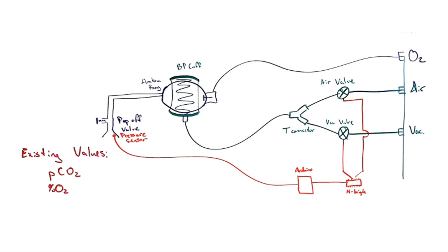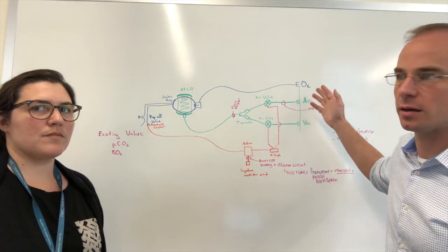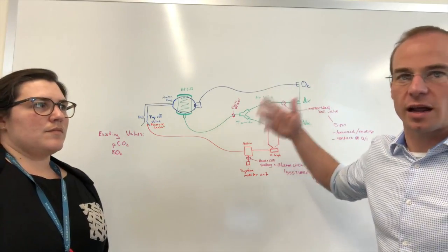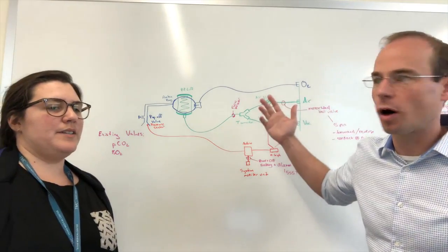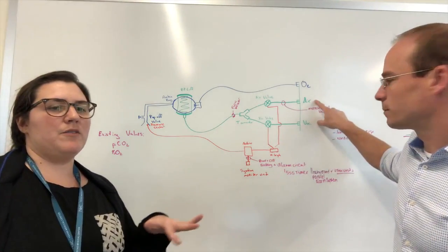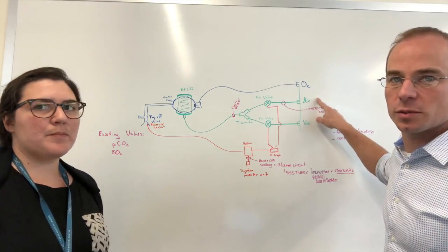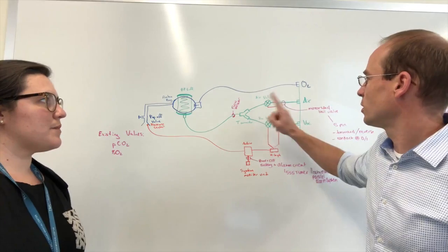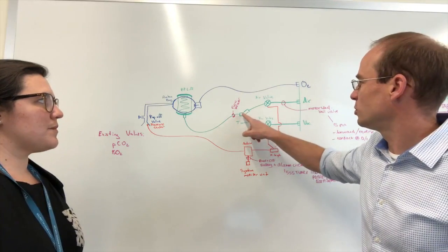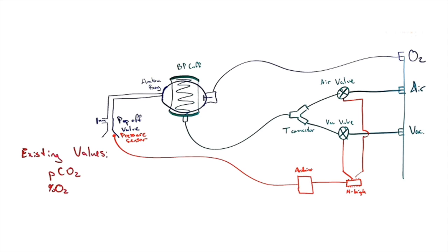So we'll start with the air supply. Right here we have an air supply that comes from the wall right now, but it might be supplied by any number of things, like an air compressor or some other pump, absolutely anything that could run many cuffs at the same time. Right now in our hospital, this would be supplied at 50 PSI, and then it goes through an air valve. The air valve then goes to a T connection and then goes to the blood pressure cuff.